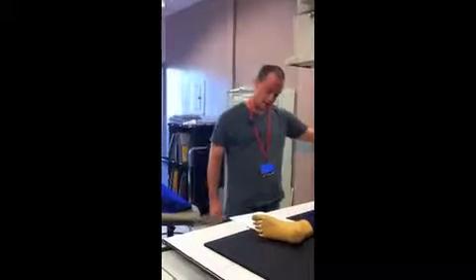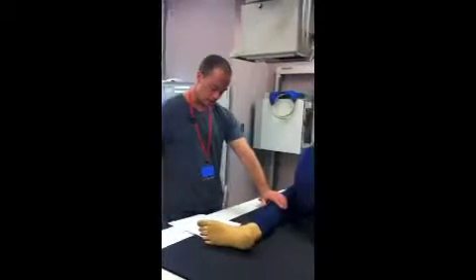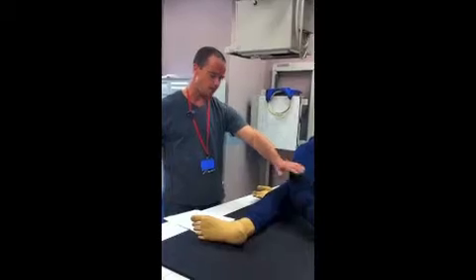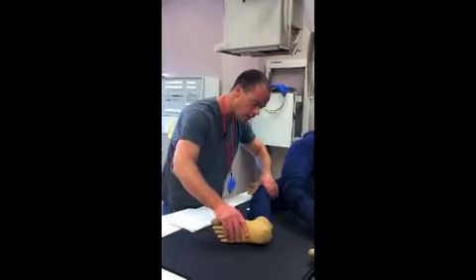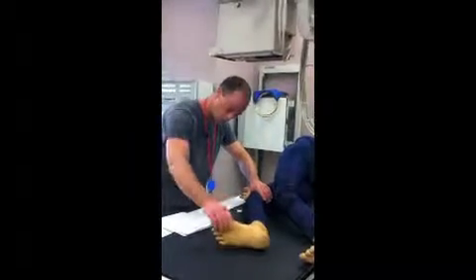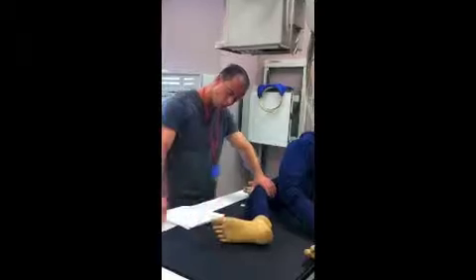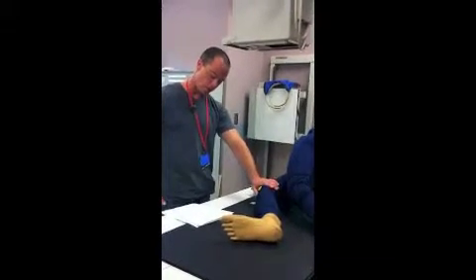Okay, so patient's laying on the affected side. You don't want any rotation of the pelvis. You want the affected knee forward and the other limb behind it. With the affected knee, you want 20 to 30 degrees flexion. If the patient can handle it, this guy can. You do the 20 to 30 degrees flexion to show maximum volume of the joint cavity.